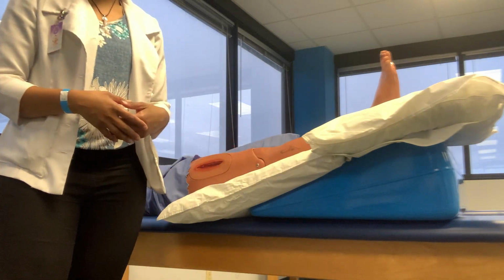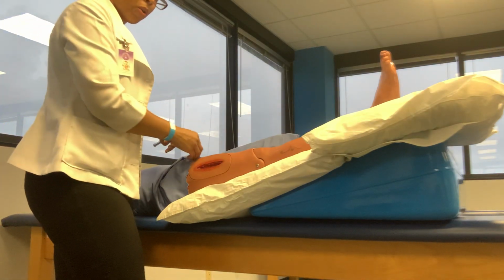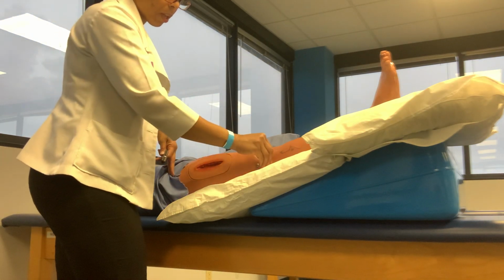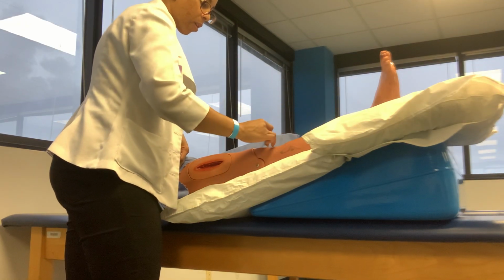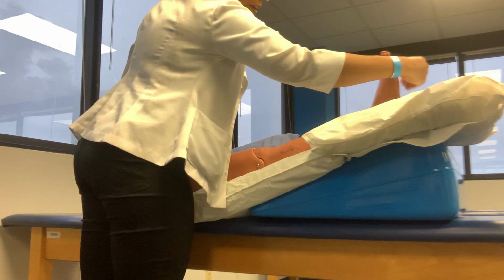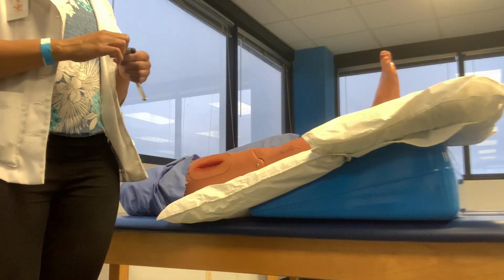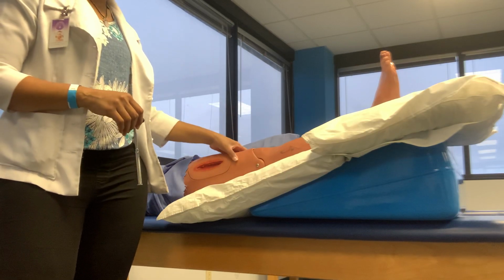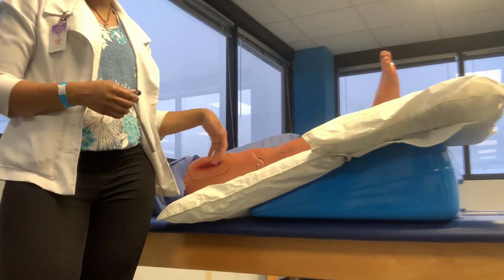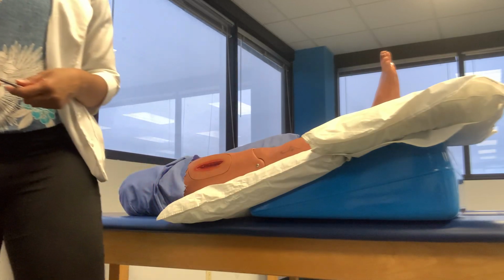After completing your thorough skin inspection, we're going to go ahead and assess the patient's sensation. You're going to go through the dermatomes and do your sensation testing with your patient so that you cover your dermatomes, making sure you've covered the entire limb to test for sensation. In the interest of time in your comp, we'll probably just say to focus on maybe 4 attempts in each area of the limb. But in the clinic, more than likely the PT would have done this before. It would be recorded on your eval. If not, then you would do it on that first session with the patient and record it in your notes.